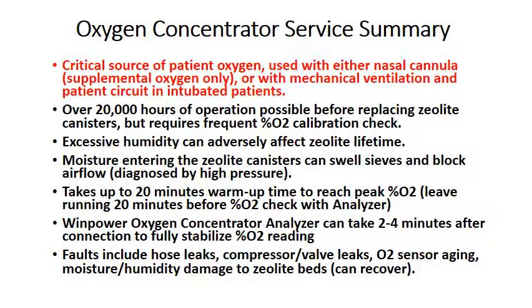Now, an average zeolite container design will often produce over 20,000 hours of operation before needing replacement. However, in places where there is excessive humidity, the lifetime can be adversely affected, and in some cases, if the moisture actually enters the zeolite canisters, it can cause the zeolite sieves to swell and actually close the airflow, and that's diagnosed by seeing high pressure at the input to the canisters.